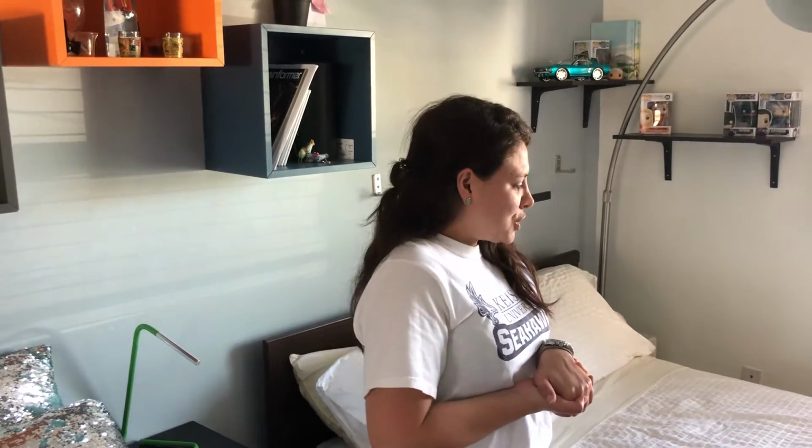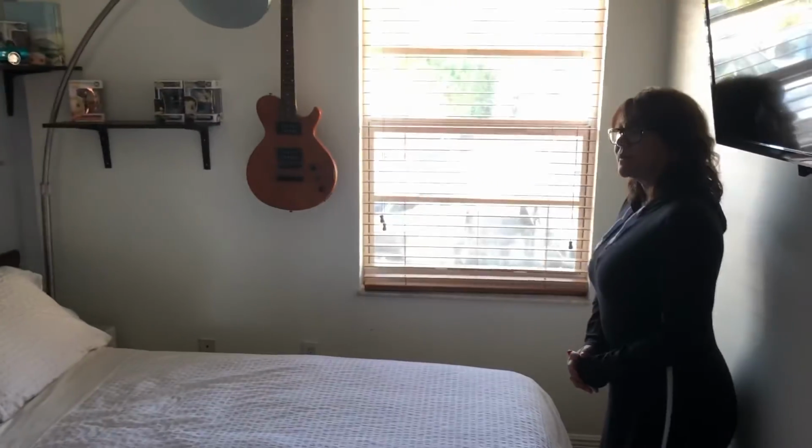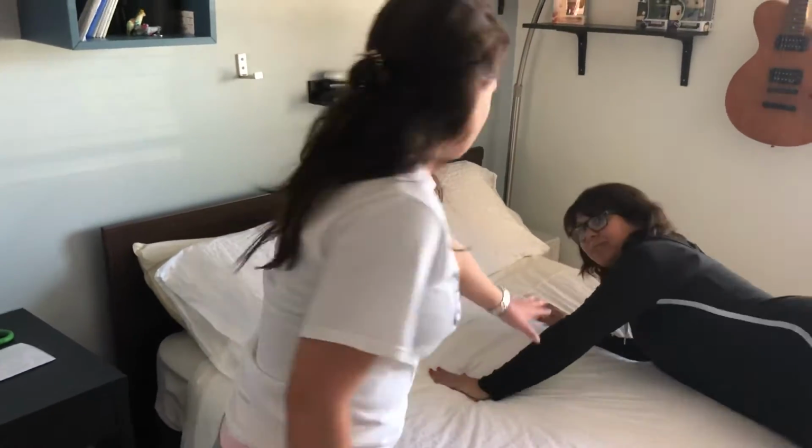Okay, so for the positioning, I'm gonna be starting with my mom. She's gonna be helping me today. We're gonna do the PA examination to see that there are not abdominal contents and the bowels are clean and nothing can obscure the anatomy. So I'm gonna ask her to lay on the bed on PA position. There you go, mommy. I have to stay there.